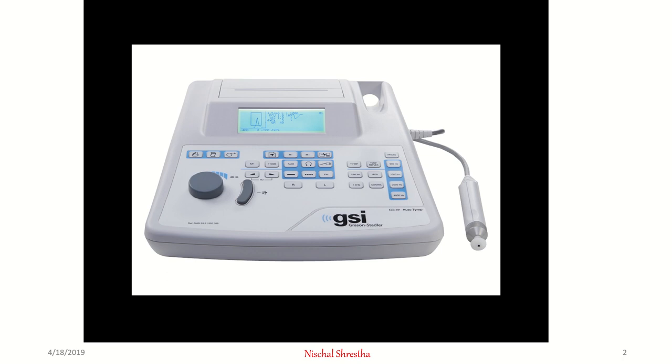This is the device of tympanometry. Here we can see one probe over here. This probe has 3 channels inside it, and this is a monitor where we can see the graph over here. This machine automatically plots the graph. Doctors don't have to ask the patient, and they don't have to plot by themselves. So this is an objective type of test.